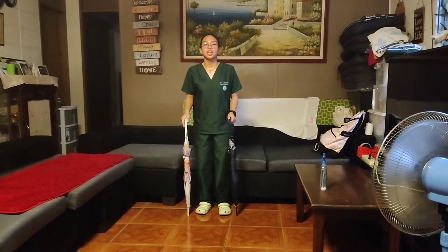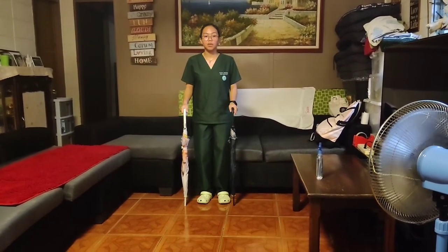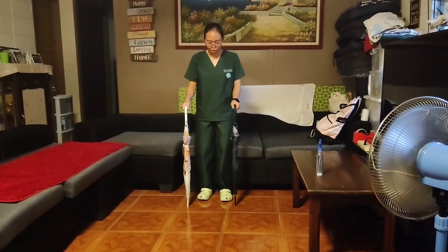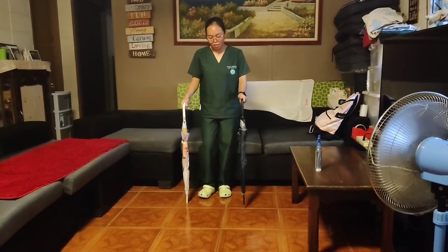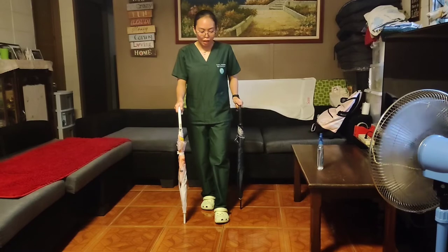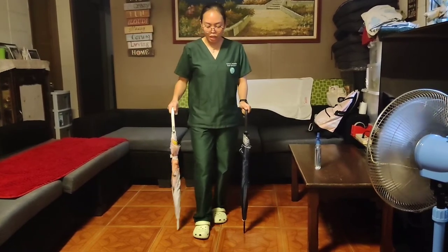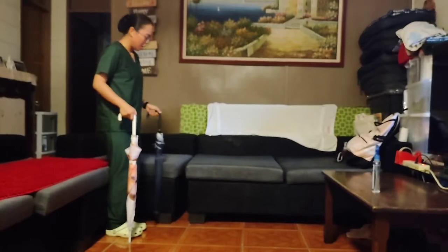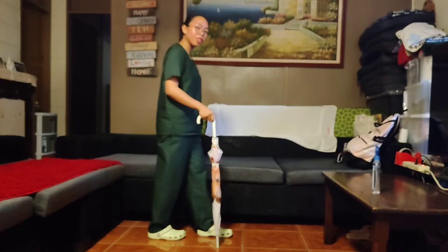Next, instruct the patient using the 2-point gait. Begin with the tripod position. Move the left crutch and advance the right foot together, then move the right crutch and advance the left foot together — pairing opposite crutch and foot simultaneously.